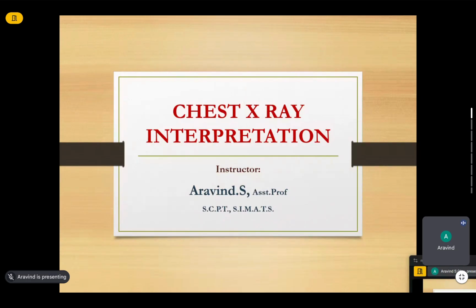So this being said, the very purpose of this session is to give a basic outline, a formula, of in what way we have to interpret chest X-rays. At the end of the session, we'll be aware of the basic outlines of chest X-ray interpretation from the perspective of physios. There is a systematic approach when we start interpreting chest X-rays. We shall discuss them one by one. So let us dive into the session now.